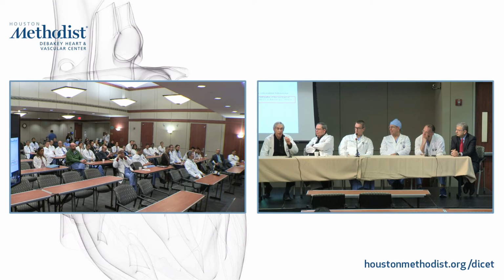We see this very commonly in patients who have endocarditis, where we find fistula formation. And although we're not a functional technique in terms of looking at flow, we can certainly see anatomically those kinds of paravalvular abnormalities where you see fistulas around the annulus going from one chamber to the next. So in many respects, CT gives you a very good look at the entire structure and can certainly look at the valve nicely.